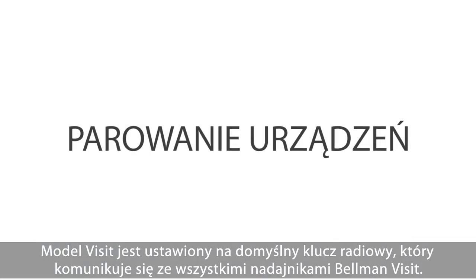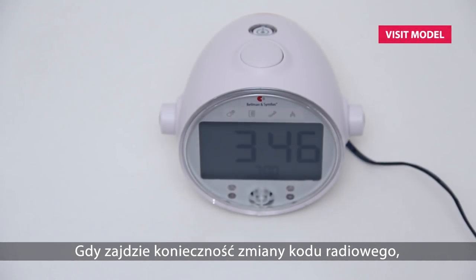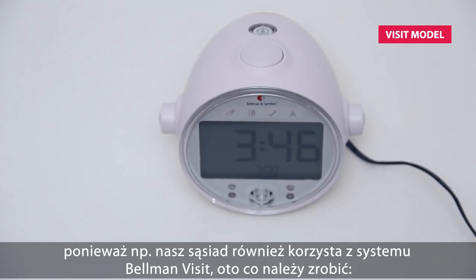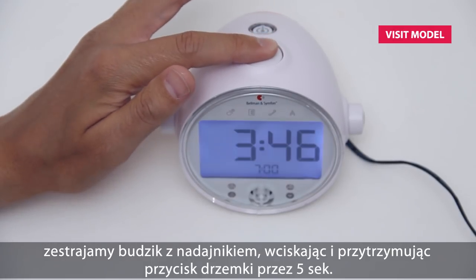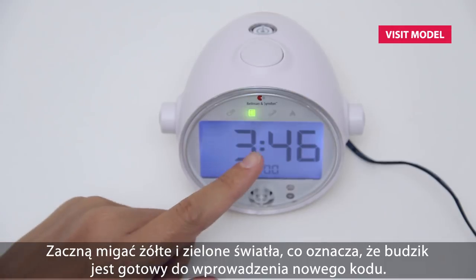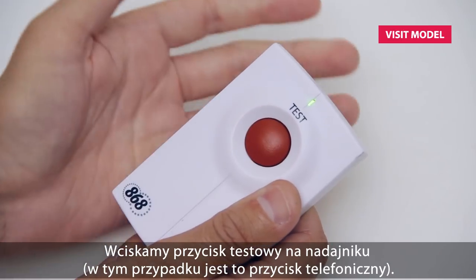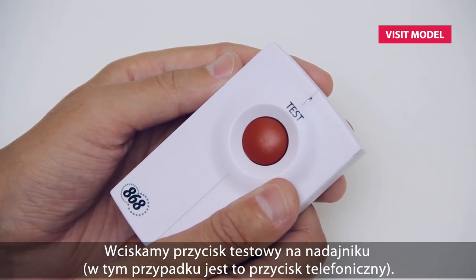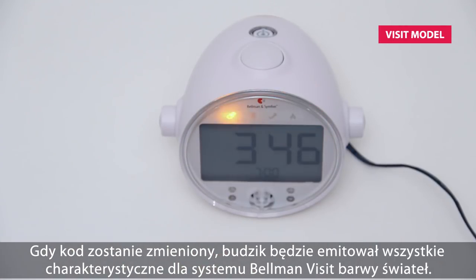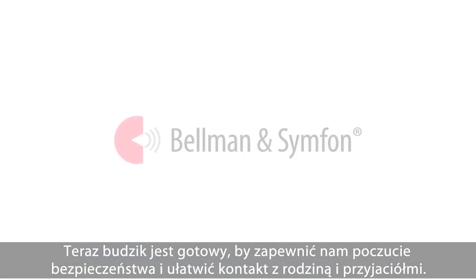The Visit model is set to a default radio key that works with all Bellman Visit transmitters. If you need to change the radio key — for instance, if your neighbor also has a Bellman Visit system installed — this is how it's done: pair the clock with a transmitter by pressing and holding down the snooze button for five seconds. The yellow and green lights will start to blink and the clock is ready to receive a new radio key. Then press the test button on your transmitter — in this case a telephone transmitter. When the radio key is changed, the clock will flash in all four distinctive Bellman Visit colors to let you know. Now the alarm clock is ready to keep you safe and connected with your friends and family.